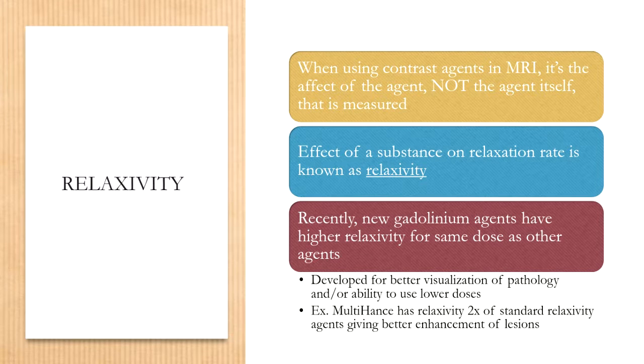Now, sometimes it's not necessary, but as you can tell, by them administering double and triple doses, they've found a third lesion in the bottom right hemisphere towards the temporal area. And that's where the yellow arrow is. So we go from one red arrow on pre-contrast images to a red and blue arrow on a single dose. And then there's an extra yellow arrow added on to double and triple, and they just get more and more enhanced as the dosage increases.